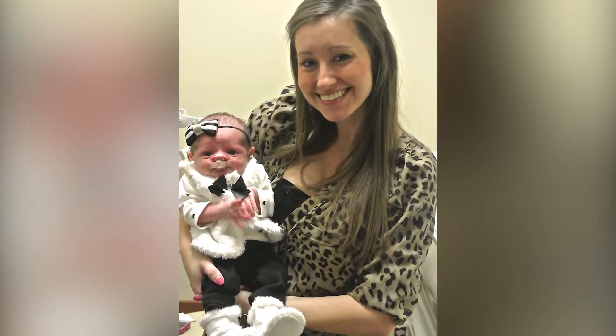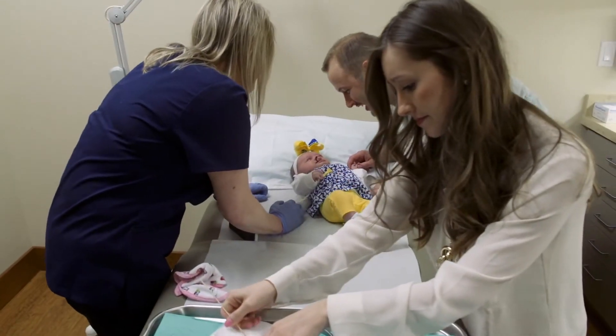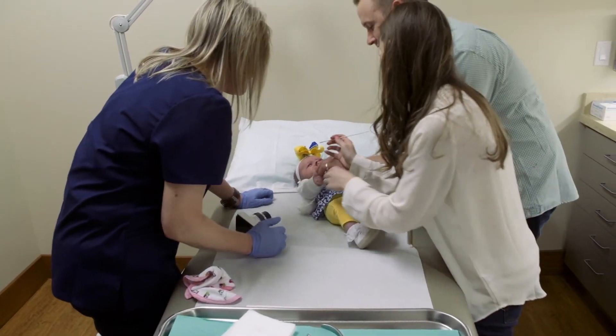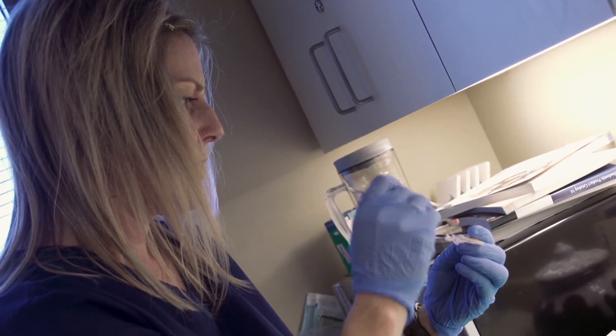When we apply the NAMM at home we kind of work as a team together. At first it started out with me putting in the retainer and him holding her down, and then as time went on we kind of reversed that. I just had that mommy instinct that I needed to comfort her and hold her right after, so he would end up putting the retainer in. It's just one of those things that you kind of dread doing every day on your baby, but it's so worth the results at the end.